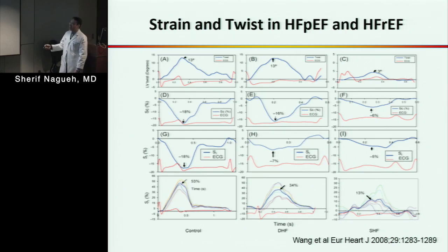This patient is not a challenge to recognize because I see their ejection fraction, I see their ventricular volumes. This is the group that is more challenging to recognize, particularly if you do not see structural abnormalities in terms of LA enlargement or in terms of left ventricular hypertrophy.